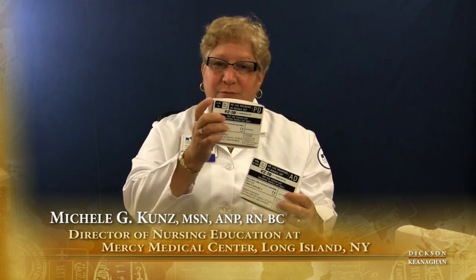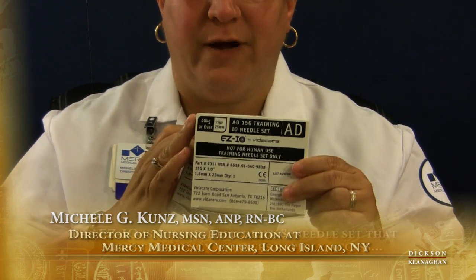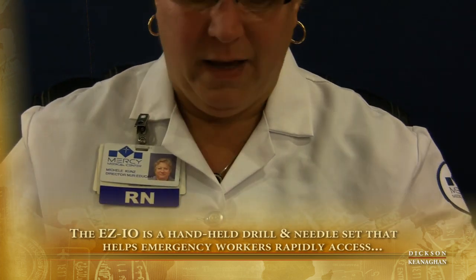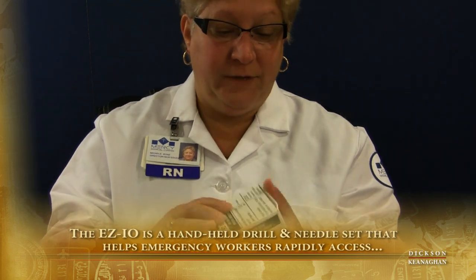The other size needles that we have — it says right on the box, it tells you by weight. So this is actually a pediatric needle. And this is for 40 kilograms or over — the adult needle. And that humerus needle is obviously for an adult as well.